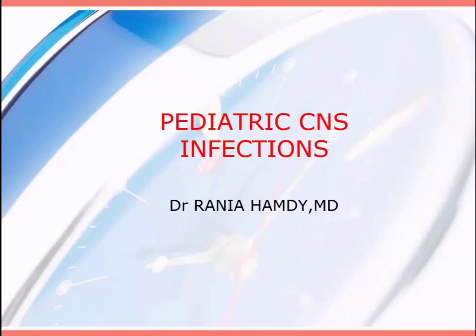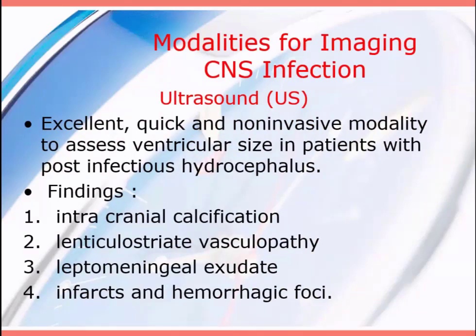Pediatric CNS infections. First, we have to deal with the modalities for imaging the CNS infection. As everything in pediatric, we start with ultrasound. Why ultrasound? Because it is non-invasive, quick, with no radiation, and available and easy, and can be bedside. But here we have the obstacle that it can be used only until the anterior fontanelle is closed.